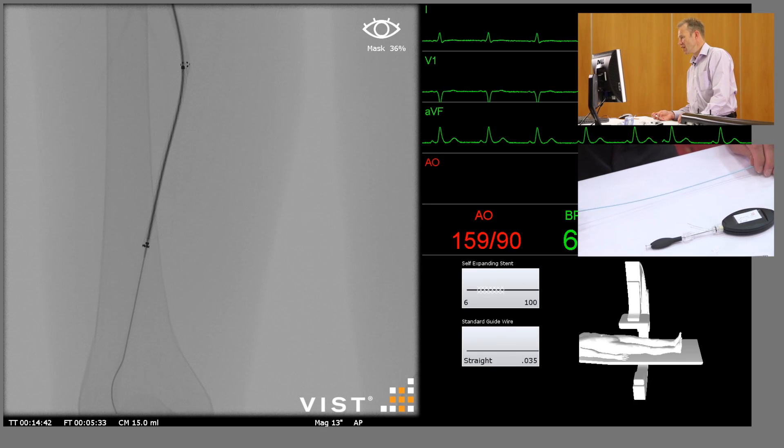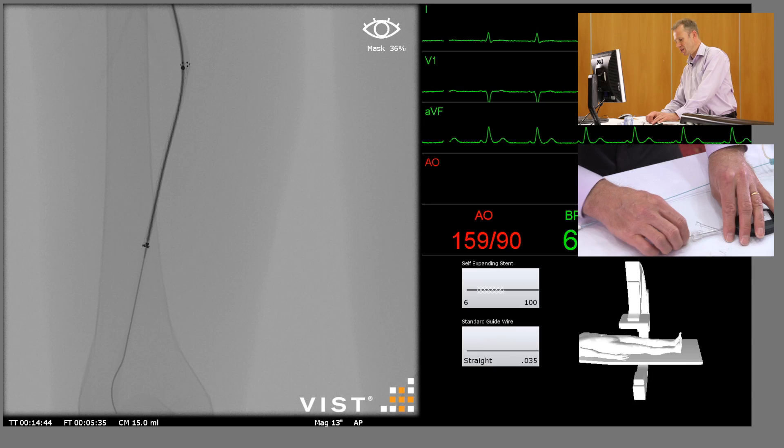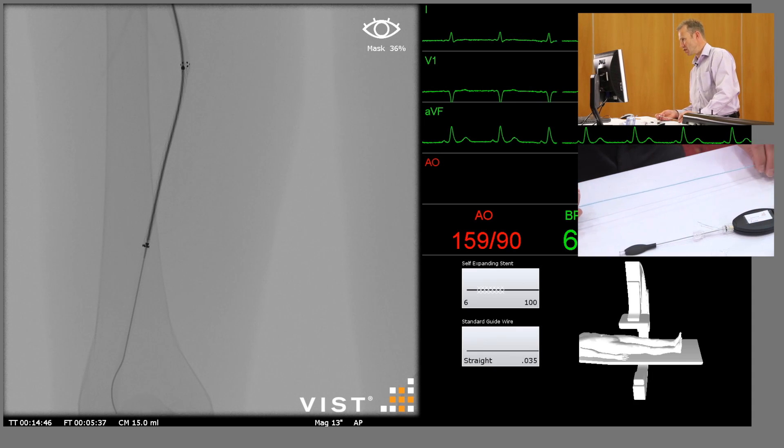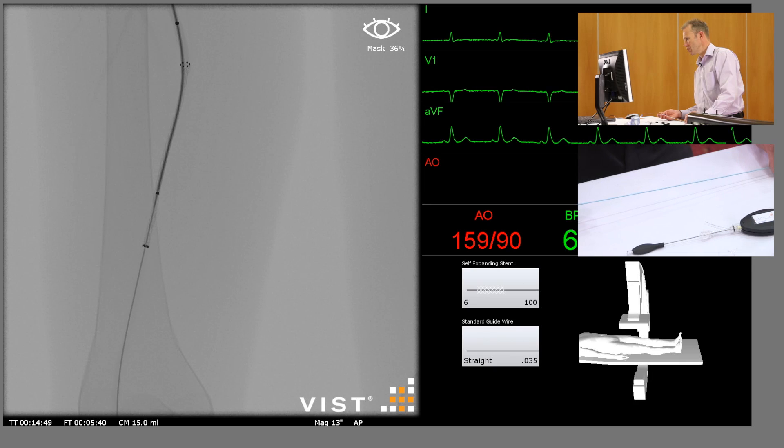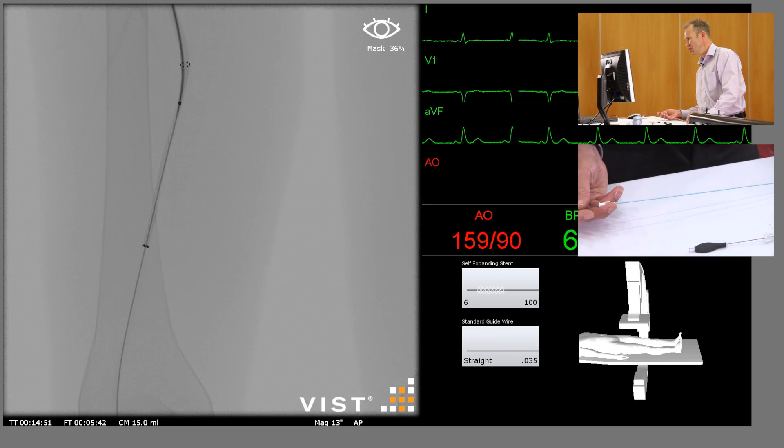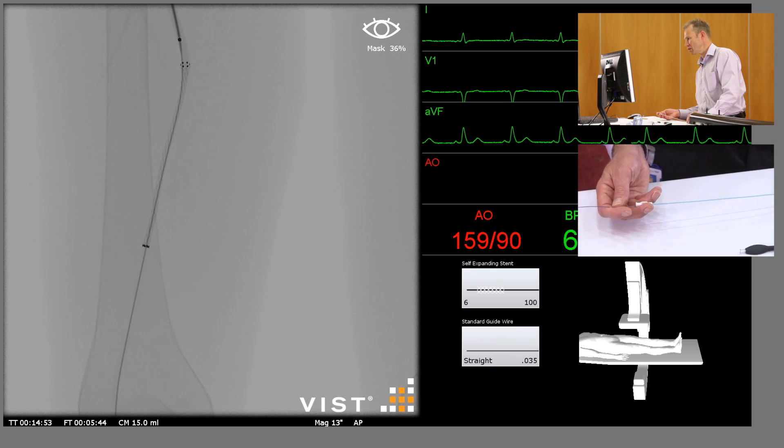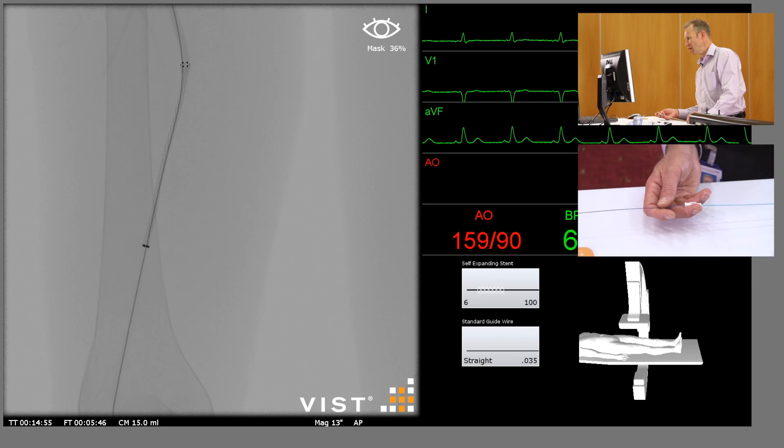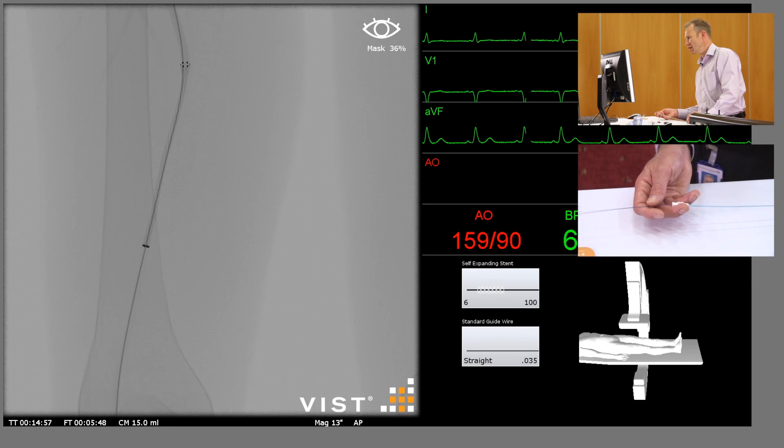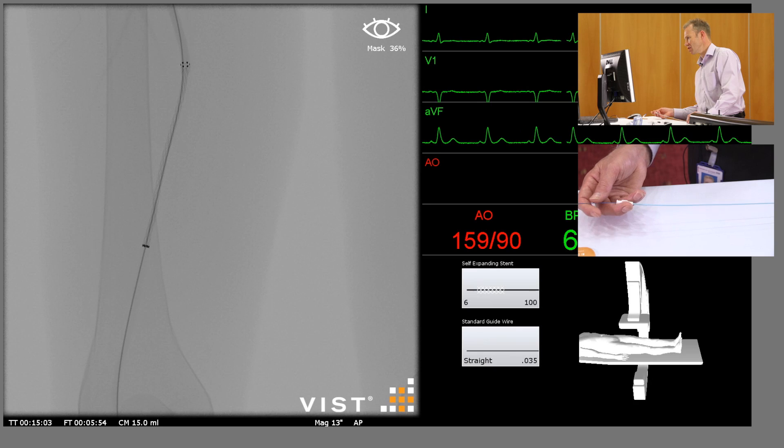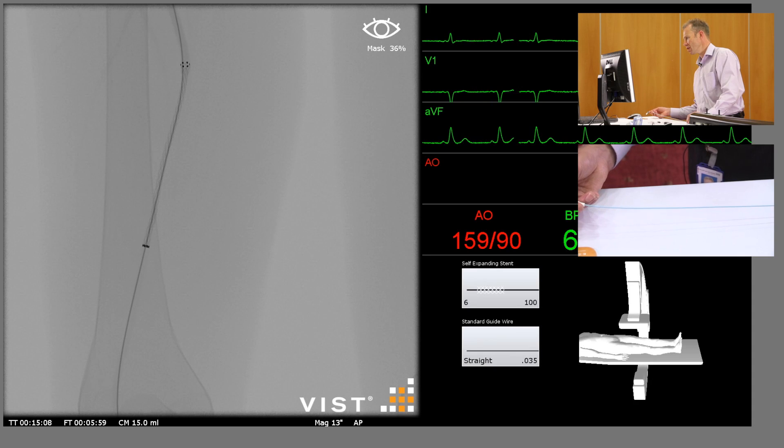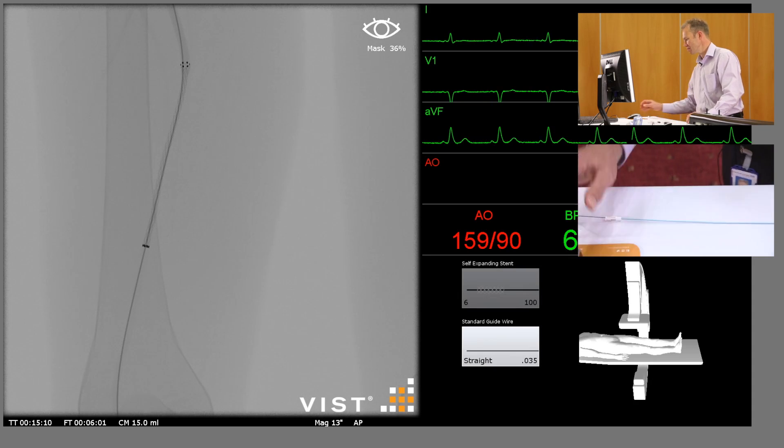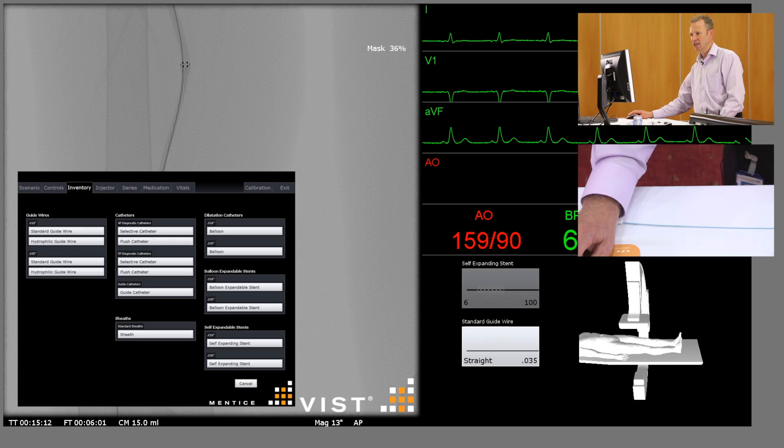Now what we need to do is withdraw the mounting system that the stent's mounted on, so I'm just going to slowly withdraw that whilst keeping my guide wire in position. It's important that the guide wire doesn't come out at this point because we might not be happy with the final result. You can see the stent actually needs further expansion, so what we're going to do is put in a six millimeter angioplasty balloon and give it a bit of a stretch.